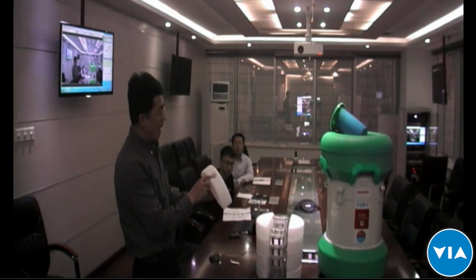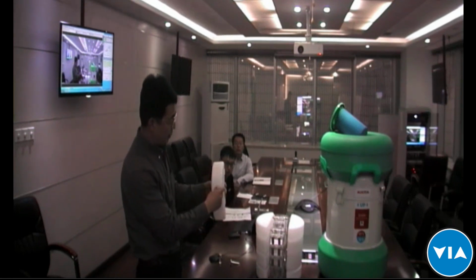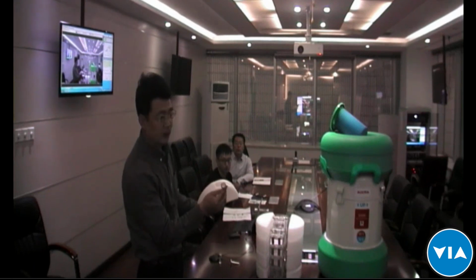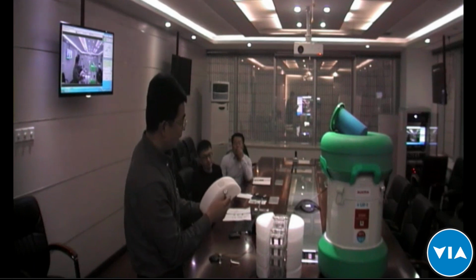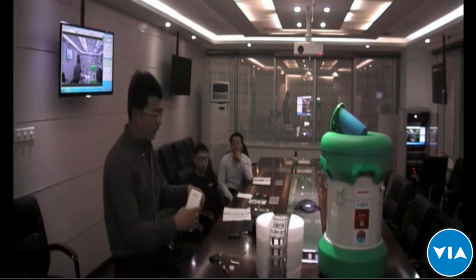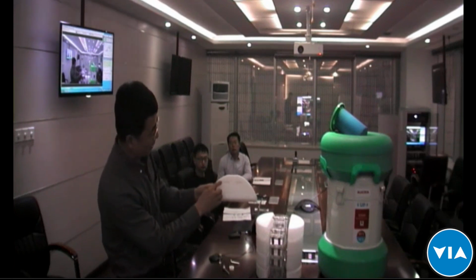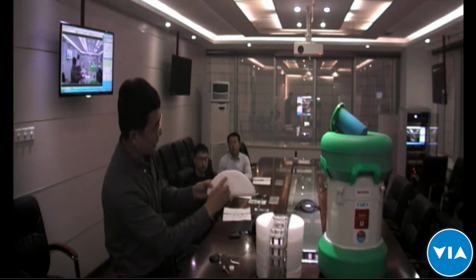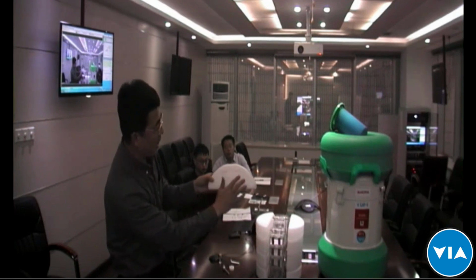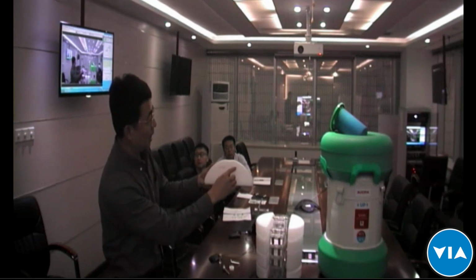Okay, first is how to fill the water into the ice blocks. We need to unscrew the cap and take the stopper off. After this, we can fill clean water into the ice blocks until the red line. I'm not sure if you can see the red line marked on the outer side of the ice blocks. And do not overfill these ice blocks. I think the water line is perfect.